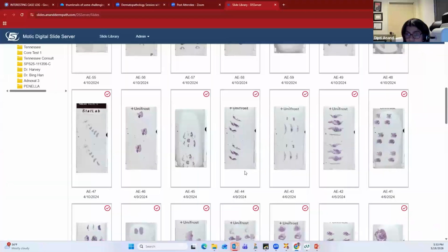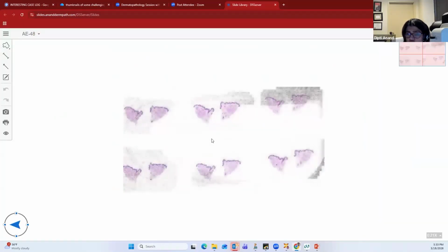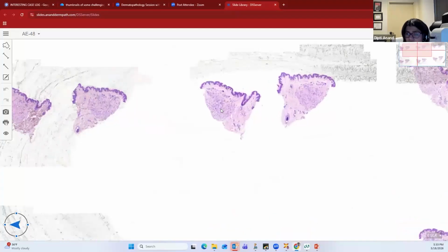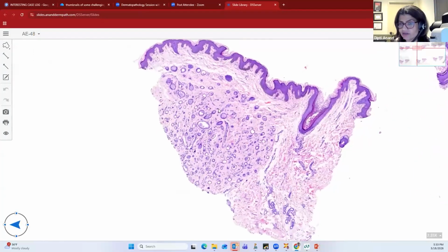One of the last tumors that we're going to talk about is going to be tumors which are again on a shave biopsy can be difficult to distinguish between them. So this is a syringoma, desmoplastic trichoepithelioma, and a microcystic adnexal carcinoma. So syringoma is sweat gland in derivation, and desmoplastic trichoepithelioma is a follicular tumor. So we'll talk about both of them.